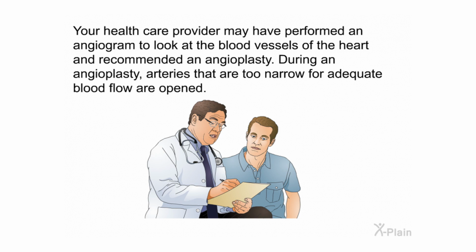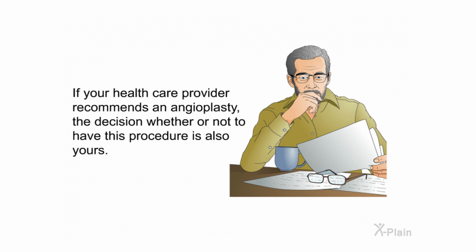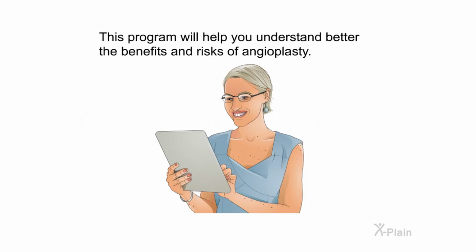Your healthcare provider may have performed an angiogram to look at the blood vessels of the heart and recommended an angioplasty. During an angioplasty, arteries that are too narrow for adequate blood flow are opened. If your healthcare provider recommends an angioplasty, the decision whether or not to have this procedure is also yours. This program will help you understand better the benefits and risks of angioplasty.